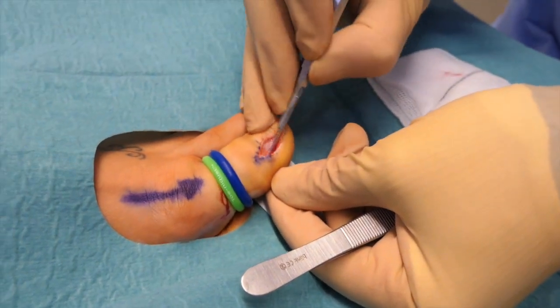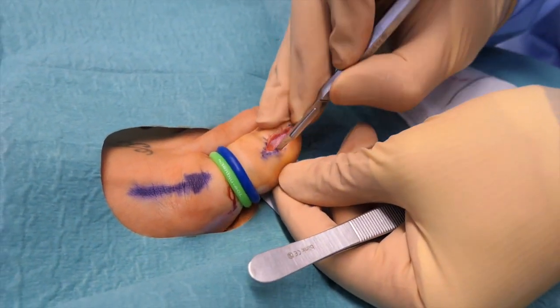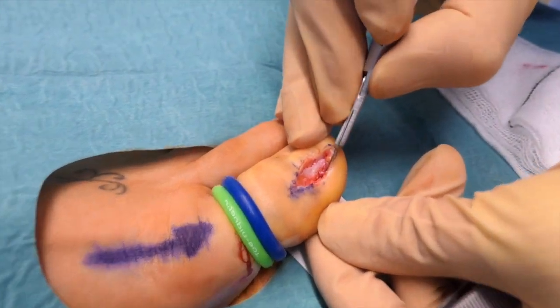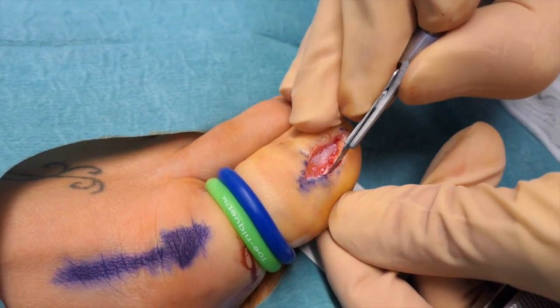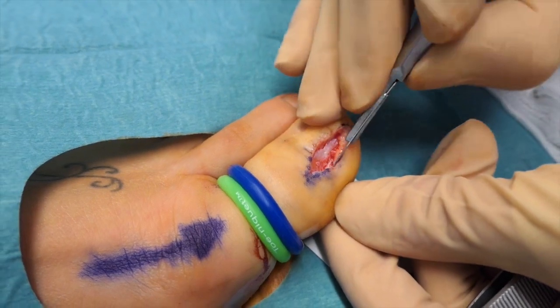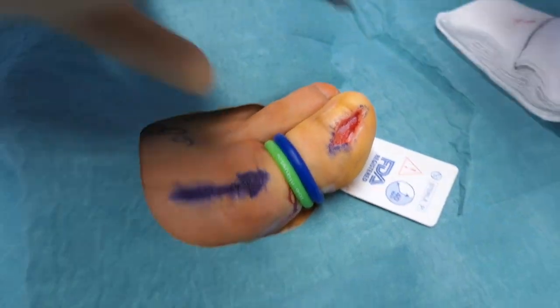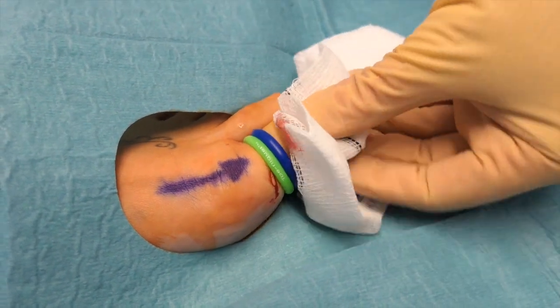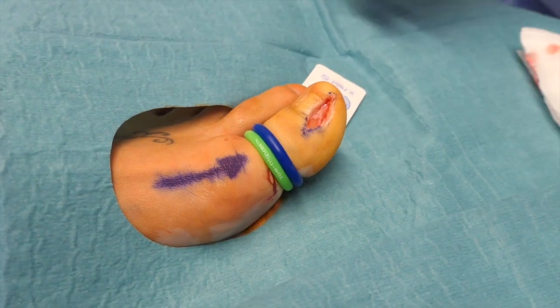And then really a case of getting all of those bits of tissue out. A little bit suspicious there, so I'm just going to undermine and just take that tissue out. If in doubt, take it out, is the surgeon's mantra. I know. And then we're going to do some suturing.